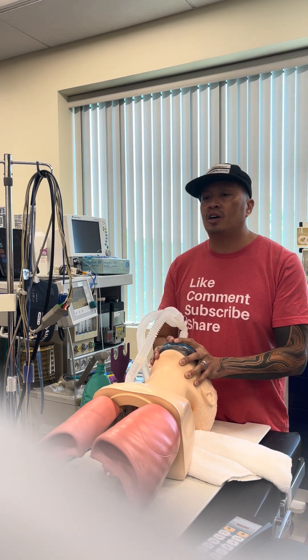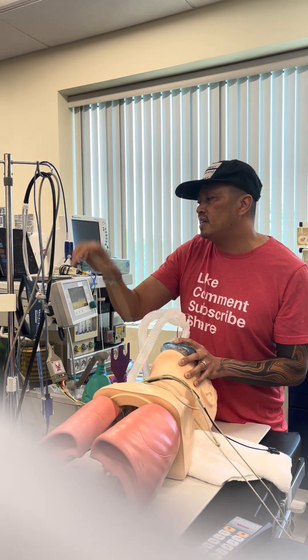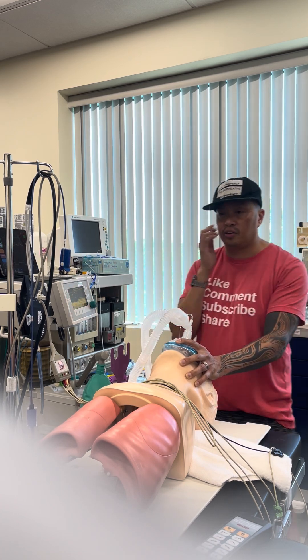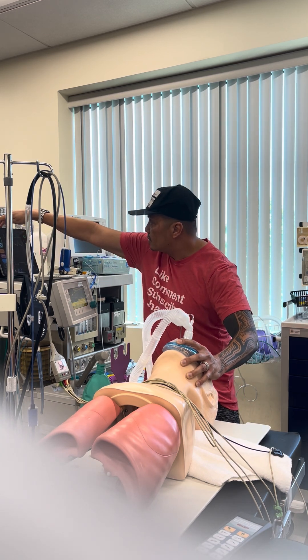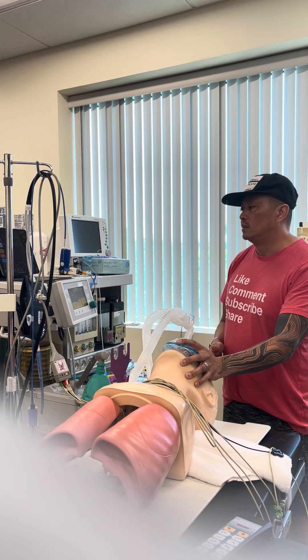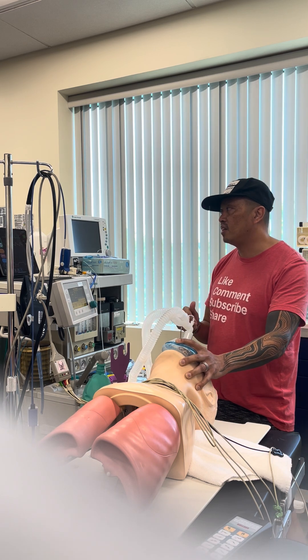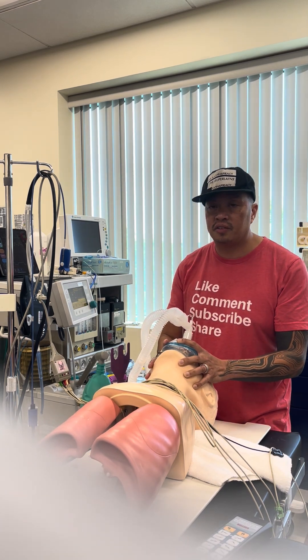Fantastic. So at this point in time, I'm going to have my assistant hold on to the mask and then I'm going to put my monitors on. I have my EKG monitors, I have my blood pressure cuff, and I have my SpO2 on his finger. I'm going to run vital signs to make sure it's appropriate. His blood pressure and vital signs are still good to go. ETCO2 is still there. He's tolerating the mask well and I've given the Versed enough time.